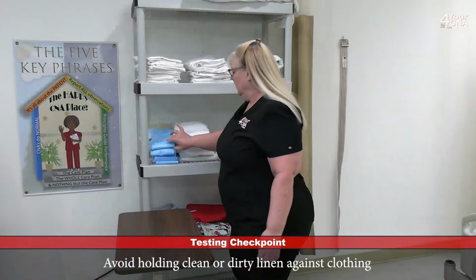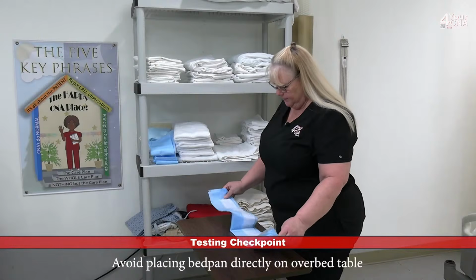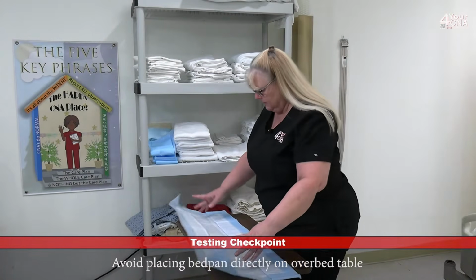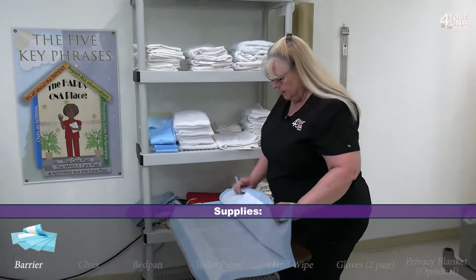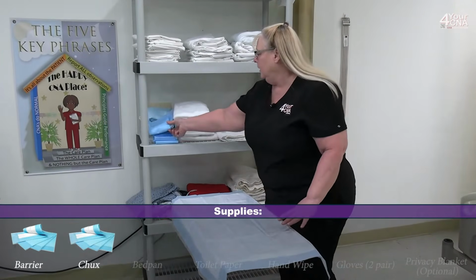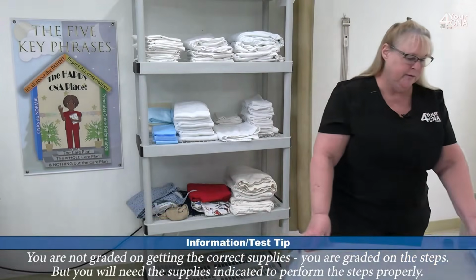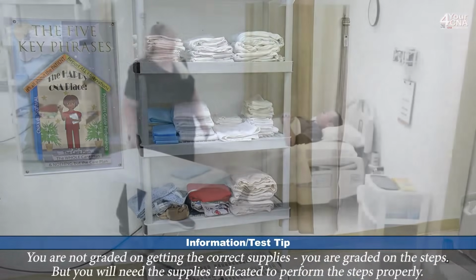After I've washed my hands, I'm going to get my supplies. I'll start with a barrier, unfolding it with the absorbent side facing up, and this is going to give me a clean place to put my clean supplies. We're going to start with the chucks, and then I'll move over here to the patient environment.